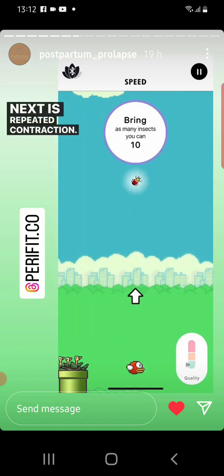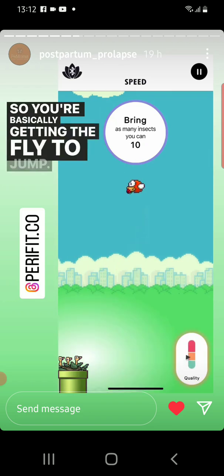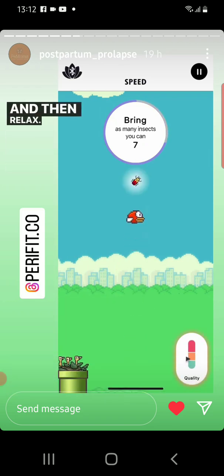Next is repeated contraction. So you're basically getting the fly to jump, and then relax, jump, relax.